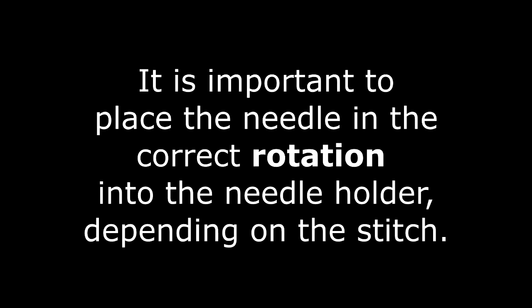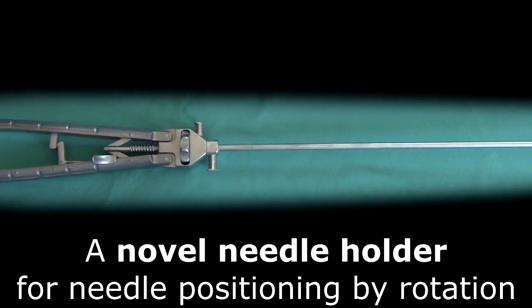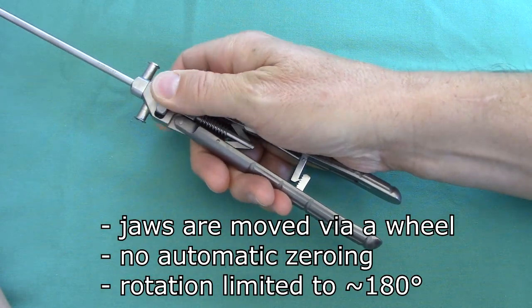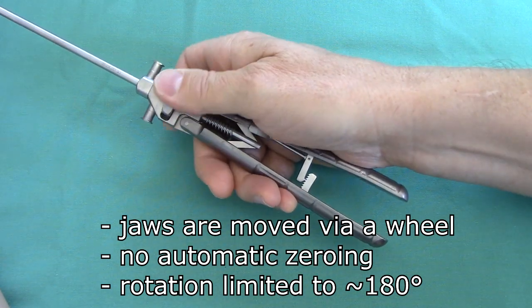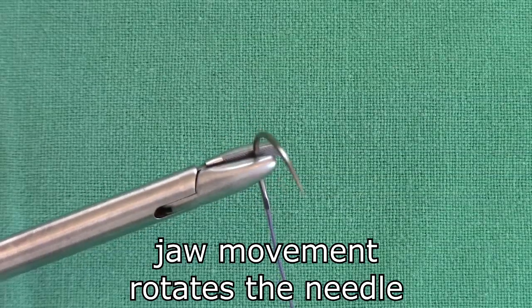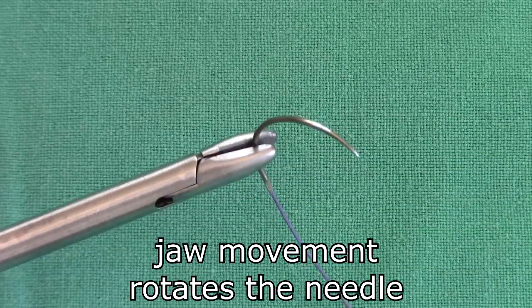It is important to place the needle in the correct rotation into the needle holder depending on the stitch. A novel needle holder for needle positioning by rotation is introduced. The jaws are moved via a wheel; there is no automatic zeroing position and the rotation is limited to about 180 degrees. In this close-up you can see the jaw movement and how it rotates the needle in the needle holder grip.